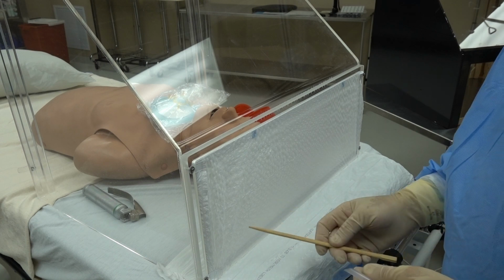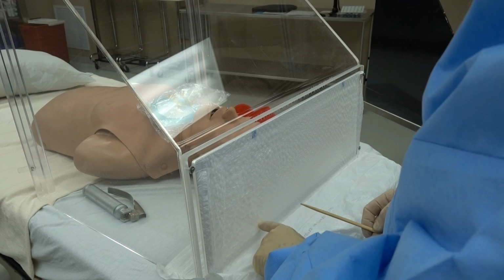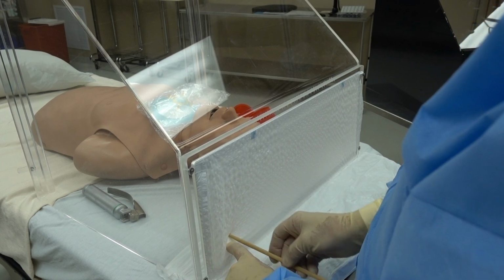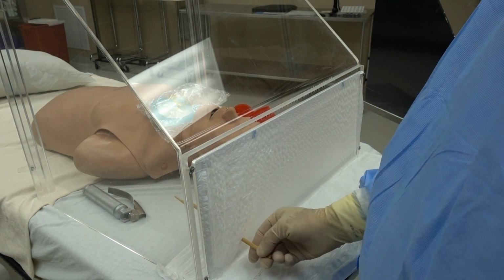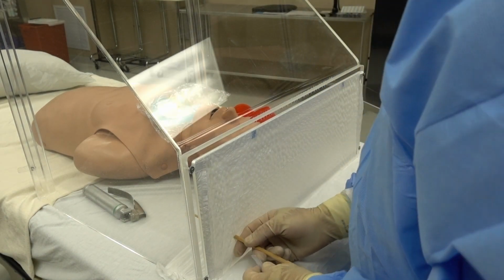So we're going to make a penetration. You can start right above this. There's a ring going around here, but anywhere you want to go, you can go. And you just push it straight through and make an opening. I don't know if you can see that, but that's in there. And you want those holes to line up. You want to go through both holes at the same time.